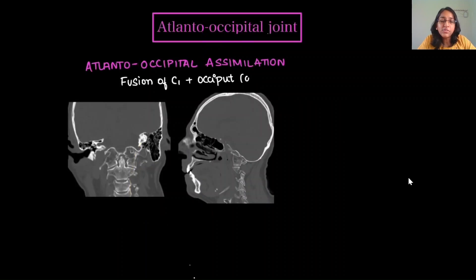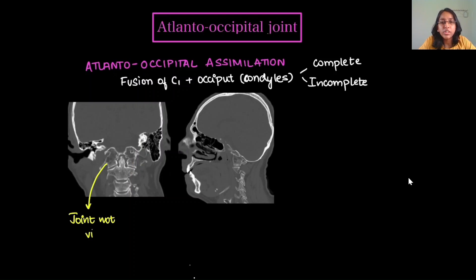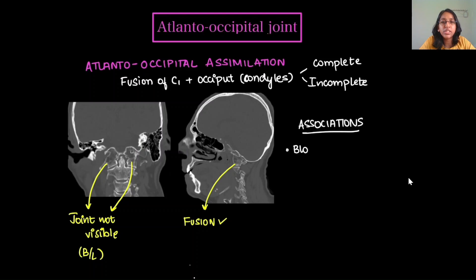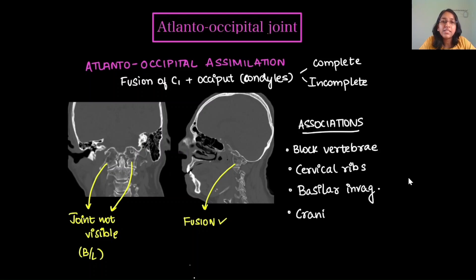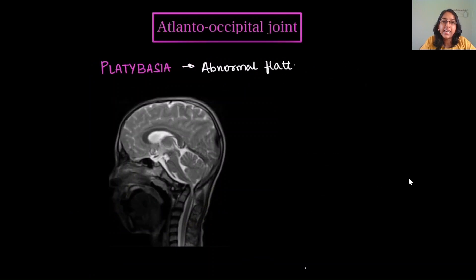Atlantooccipital assimilation involves fusion of C1 with the occipital condyles, either complete or incomplete fusion. The atlantooccipital joint space is not visualized bilaterally, and fusion can be confirmed on sagittal sections. Associations include block vertebrae — look for these along the whole spine — cervical ribs, basilar invagination, and other craniovertebral junction instability.